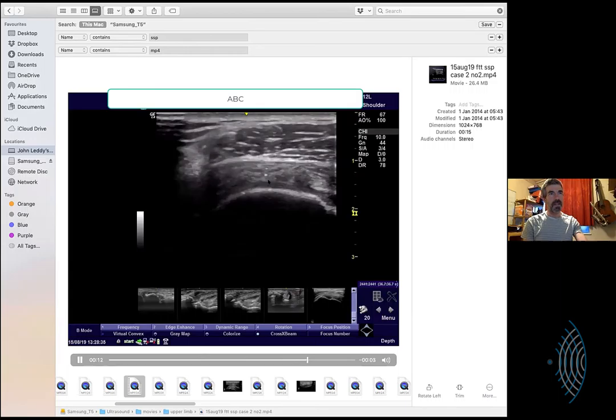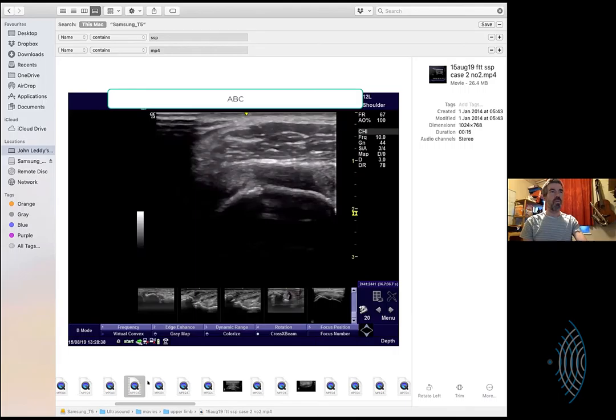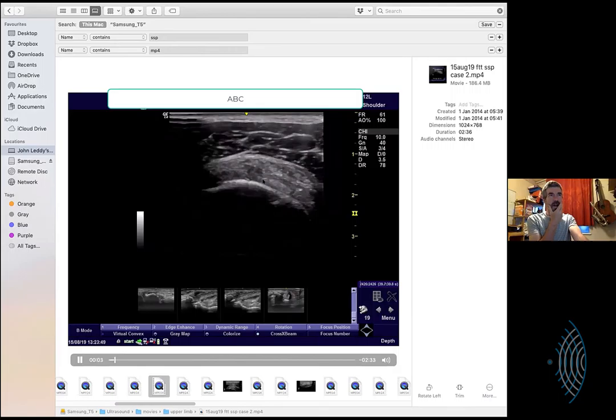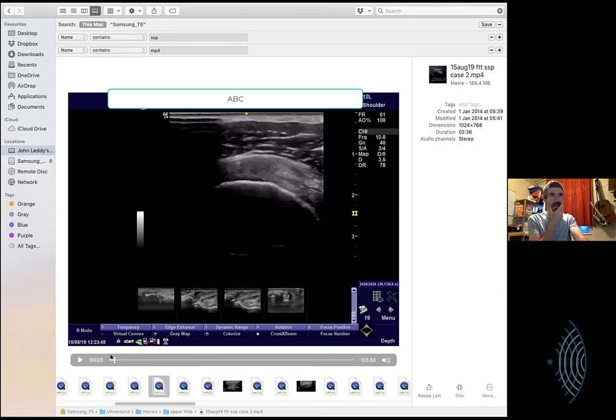What's going on? This is a full thickness tear of supraspinatus, but it's difficult to make out. There's the biceps. This is actually, I think, a stump, meaning a retracted component. This is one of those unusual ones where the supraspinatus has pulled off proximal to the insertion. I think that's the second video. There's another video. This is the main video for this one. I've not scanned it terribly well. If you stop there, we go back.